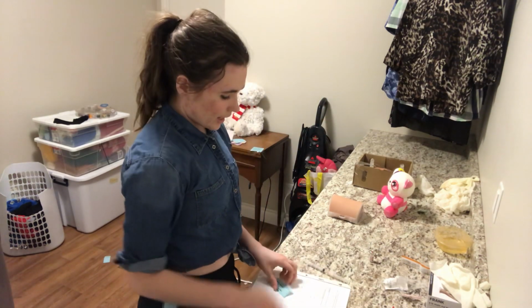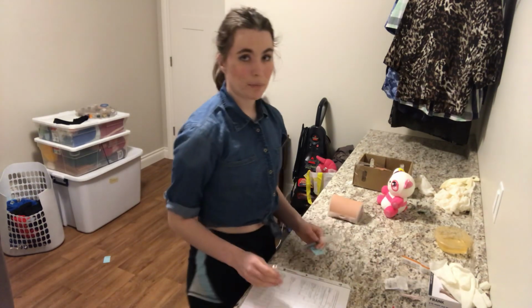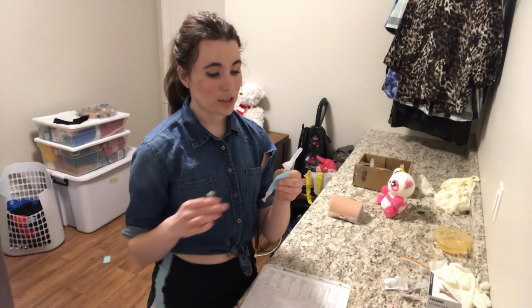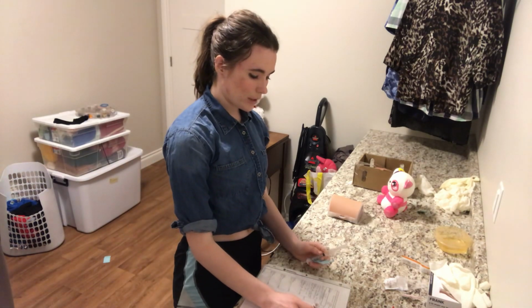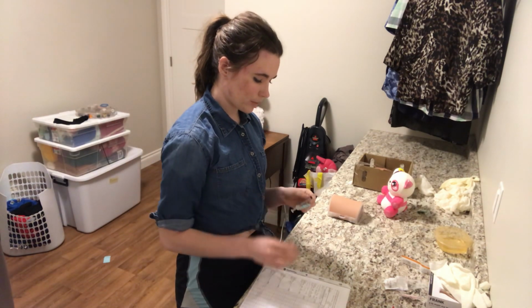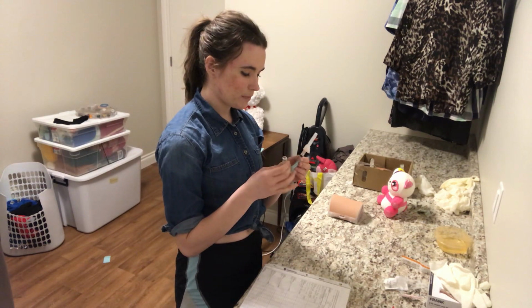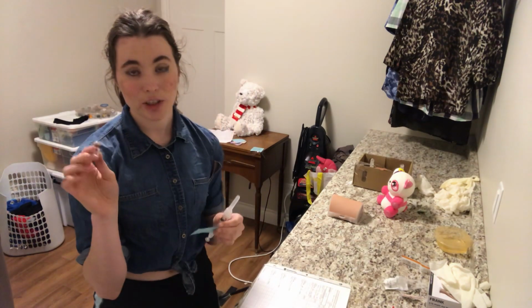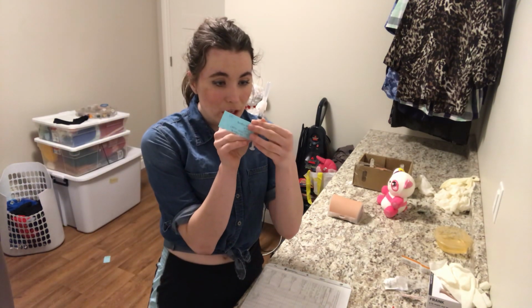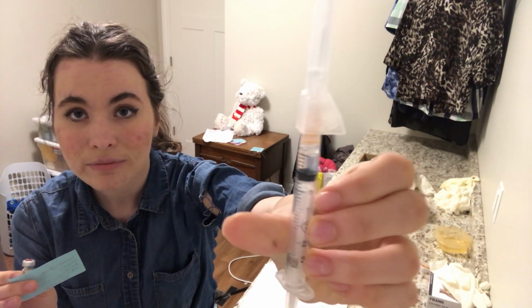So now that I have drawn my medication and I've made the label, I'm going to do my second check where I'm going to compare my MAR with my medication with the medication label with my actual syringe. So first of all, correct patient, Jake Nursing. Correct drug, heparin, subcutaneous, and heparin. And correct dose is 5,000 units. This is 5,000 units per 0.5 ml. And I see that I've drawn up exactly 0.5 ml with no bubbles on this syringe. So that's perfect.